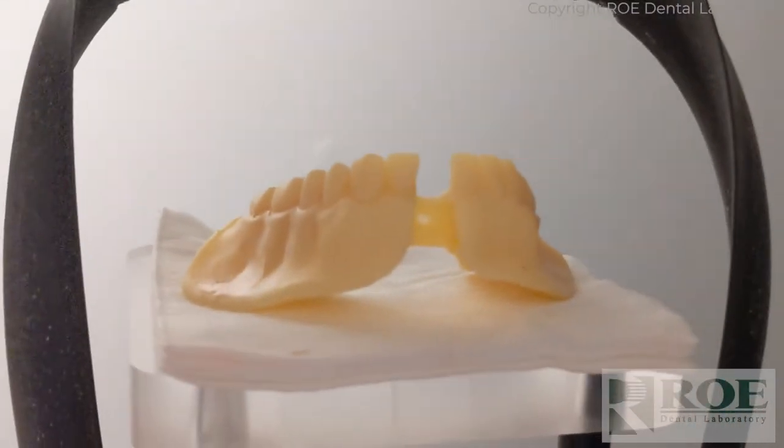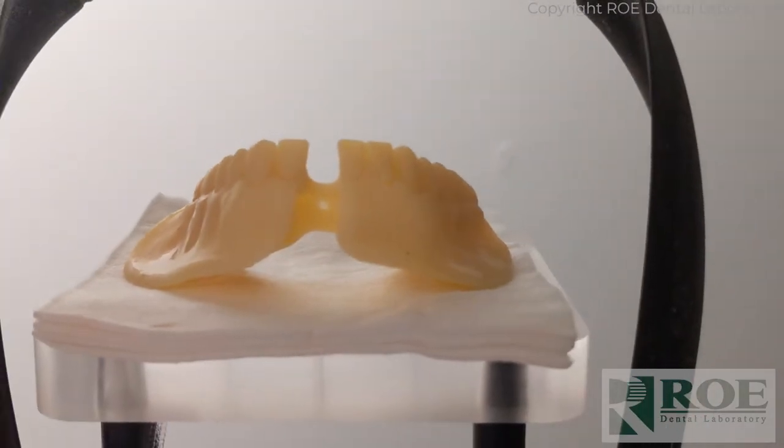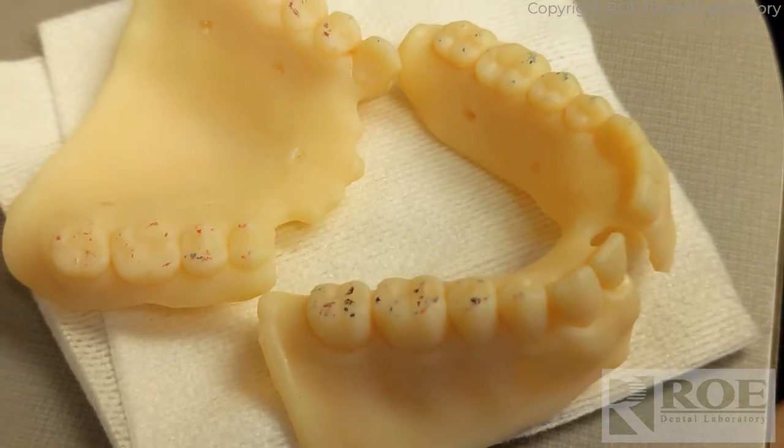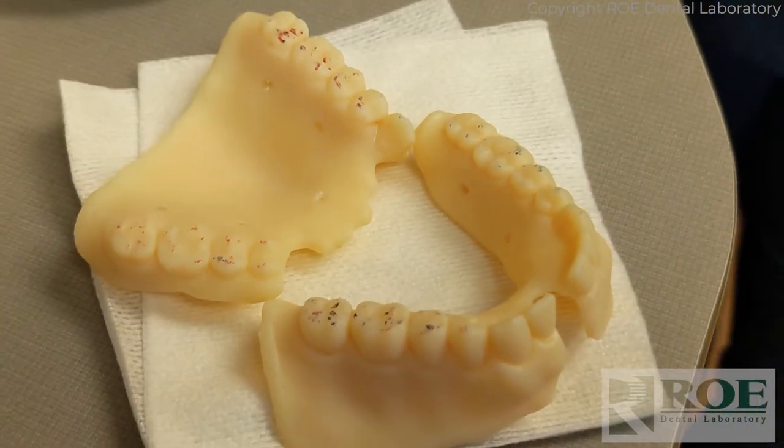The plane of occlusion isn't that important here — we just want teeth off the table. We checked it with equilibration paper and now we're going to try them in and take a bite.